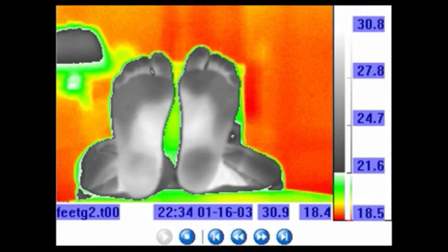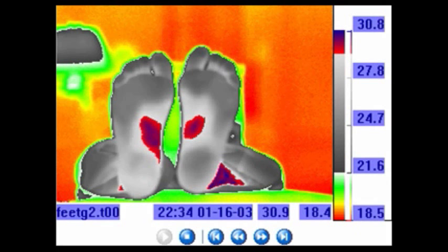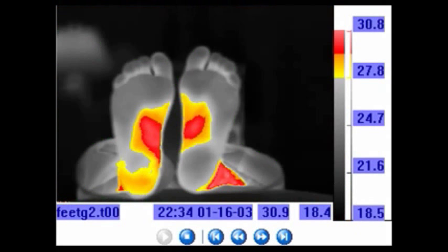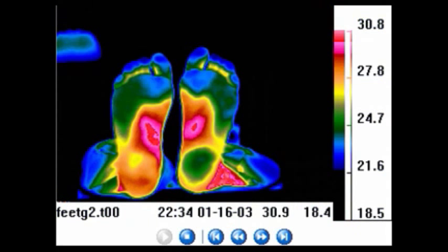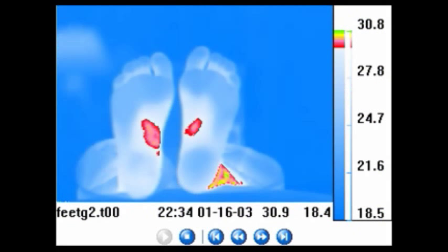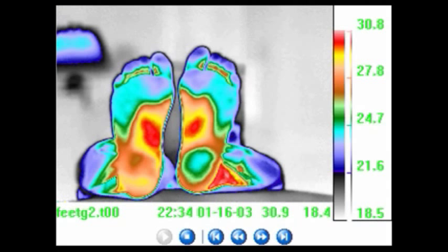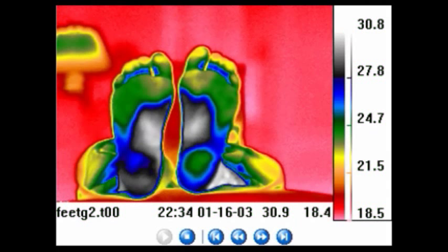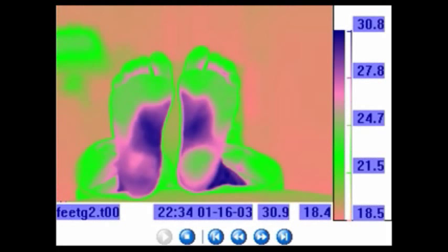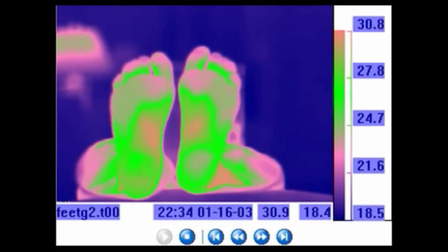The next image shows the plantar surface of the feet. And again, note what happens with the patterns associated with the metatarsal region, the arch and the heels.